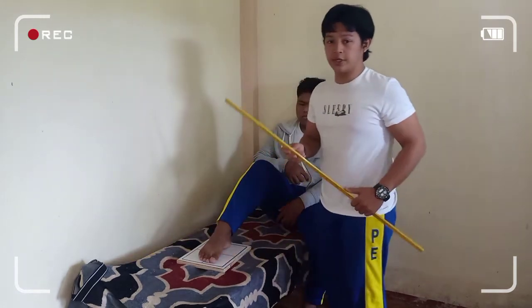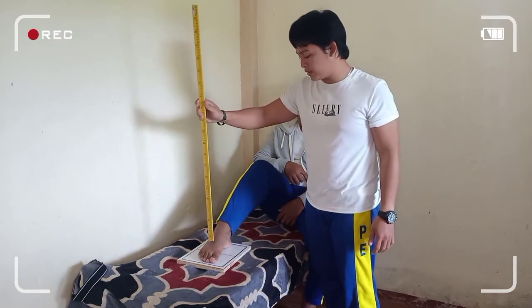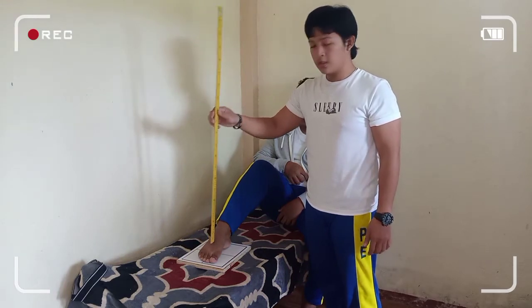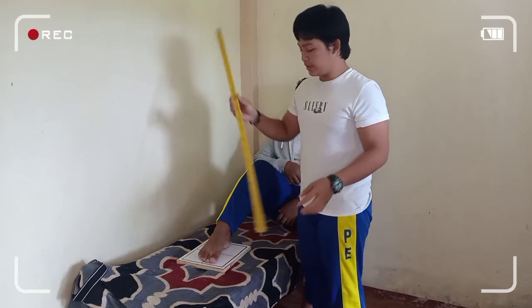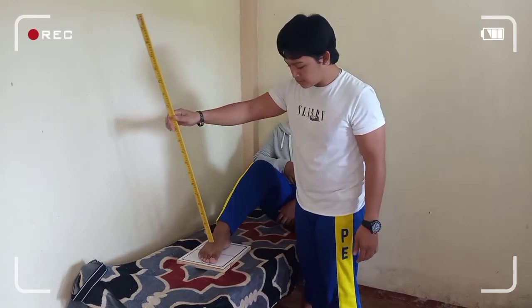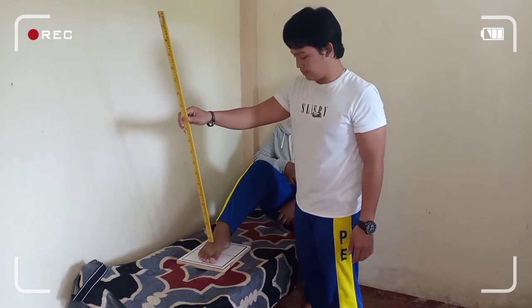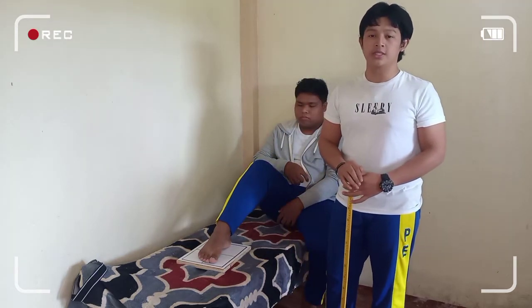For the AP projection, the central ray must be perpendicularly directed to the third metatarsal. And for the AP axial projection, the central ray must be angled 10 degrees posterior to the third metatarsal. The structures shown in this projection are the tarsals, metatarsals, and phalanges.